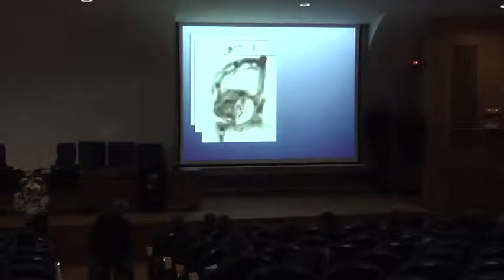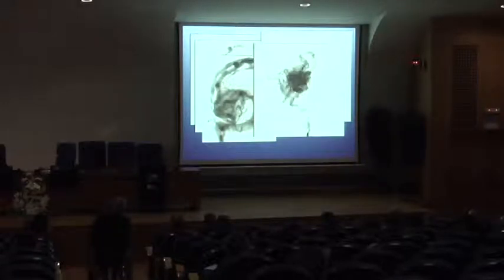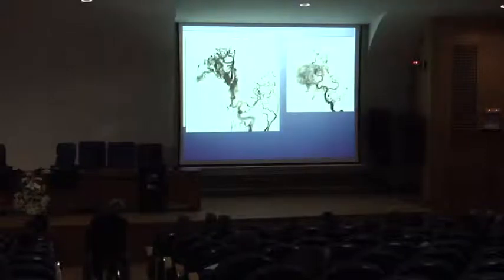This is one patient, Spetzler-Martin 5, a bigger lenticulostriate malformation. Next. In lateral view. Next. This is collateral circulation with the anterior cerebral artery. I treated with multiple sessions of embolization, about 4 sessions. Next.